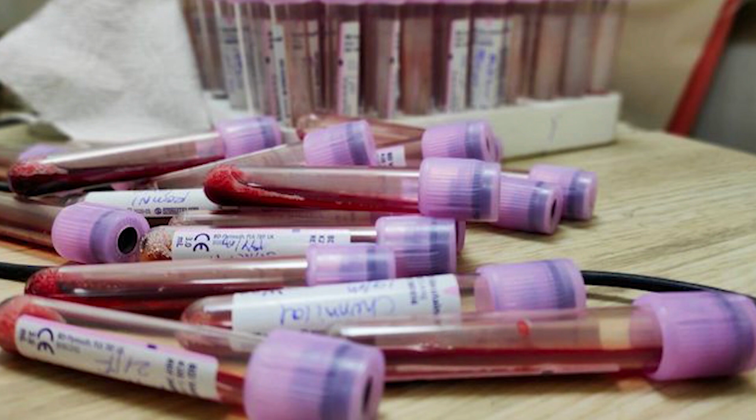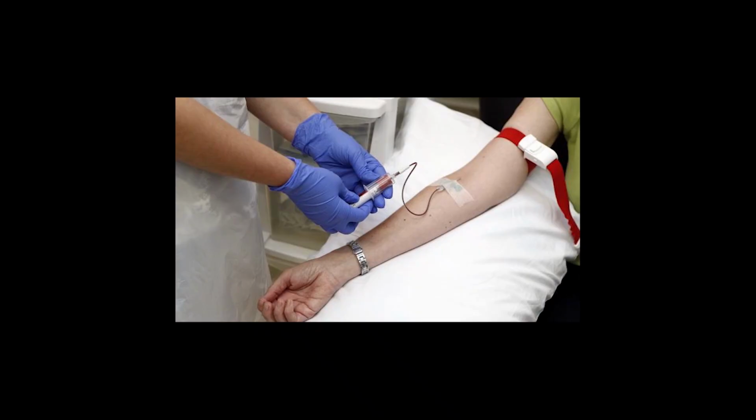Quality control policies should provide the protocol for order of draw in each lab, and the phlebotomy supervisors and quality control managers periodically check and make sure these orders are strictly followed. Okay, let's see the order of draw.